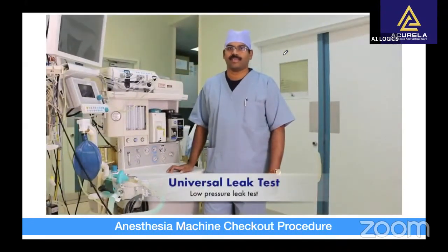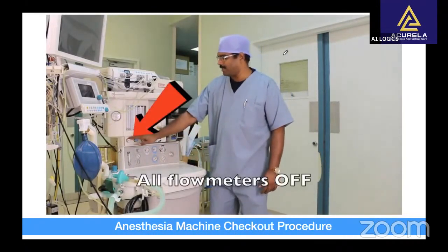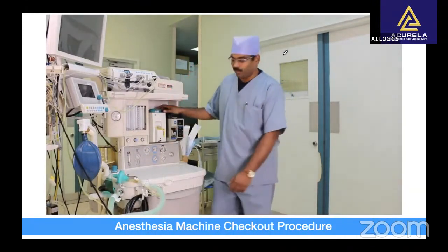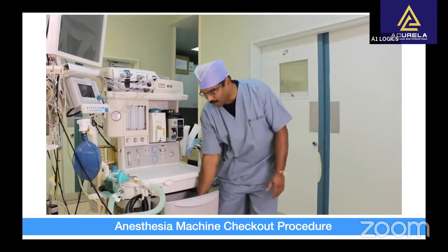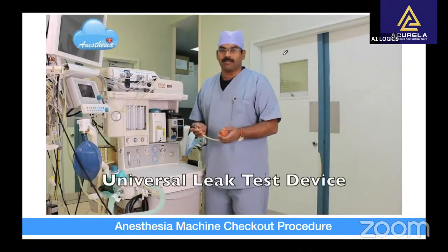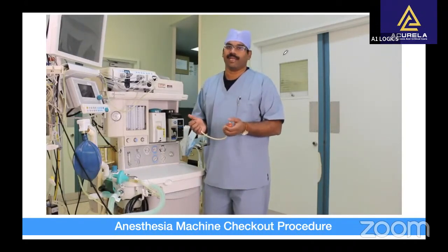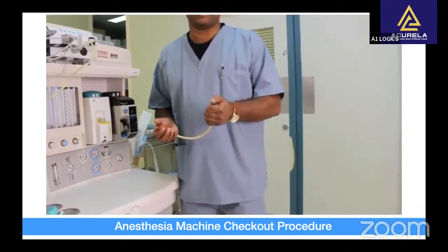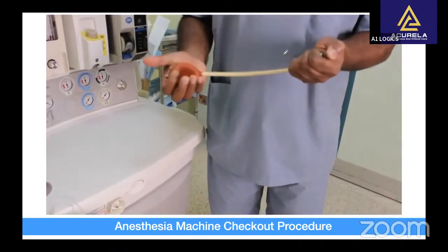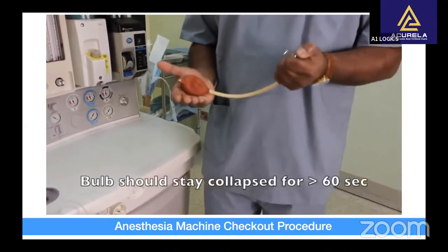Next step is low pressure leak test. Before you start low pressure leak test, make sure that all the flow meters are off, all the vaporizers are off, and you need low pressure leak test device. This is also called as universal leak test. This has got a suction bulb and an inlet. And the first step will be to check this equipment for any leak. First, make a good finger seal at the inlet and repeatedly squeeze the bulb so that this bulb is collapsed, and this bulb should stay collapsed for at least 60 seconds.